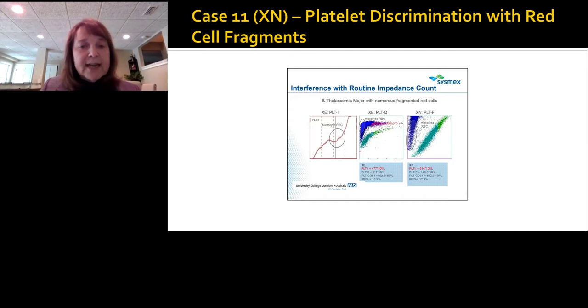And when we looked at Platelet-F, which in this case uses a fluorescent probe specific for platelets, we saw 140. So this tells us, in this particular case, there was about an 80% error if you had used a platelet I. They confirmed this by actually running on flow cytometer as CD61, which is a platelet marker, and they showed that indeed the count was 152.